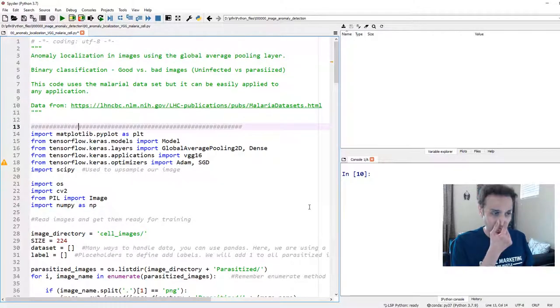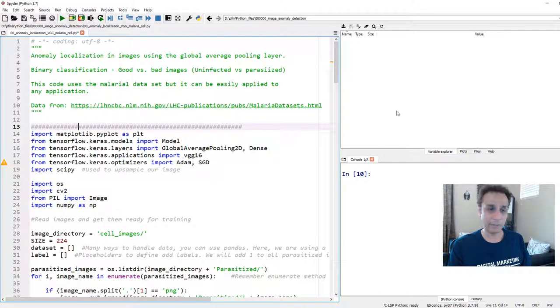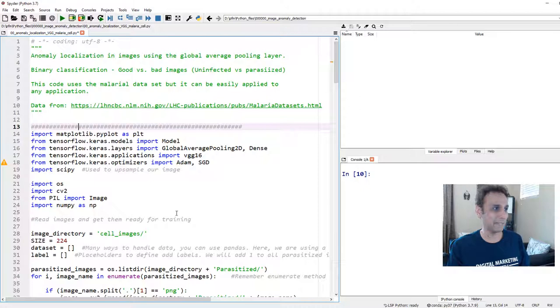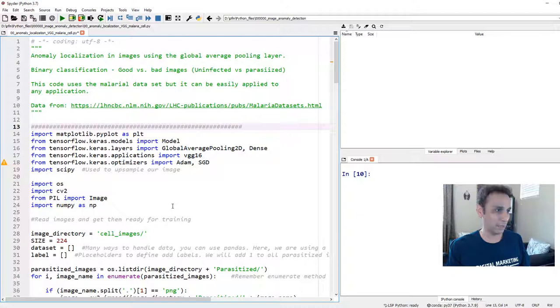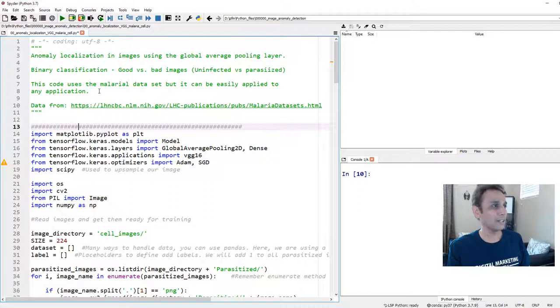As usual, I'm working in my Spyder IDE because I love it — I can see all the variables up here and the output right here. It doesn't matter what IDE you work on, I'm just giving you information on what I'm using. The dataset I'm going to use is the malaria dataset. You can download this from the link shown. When you download it, you'll see a folder called 'cell images'.